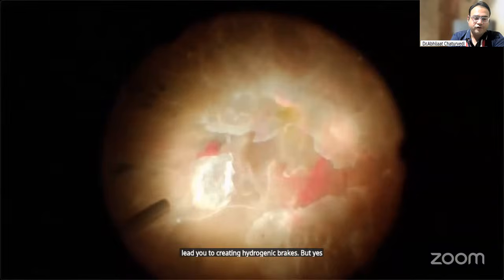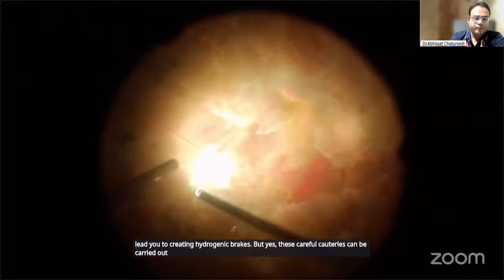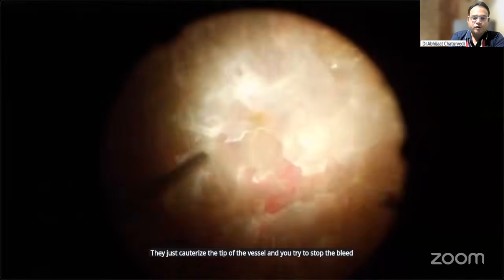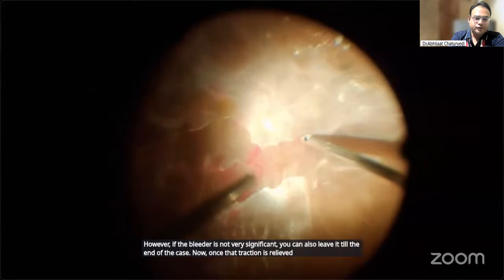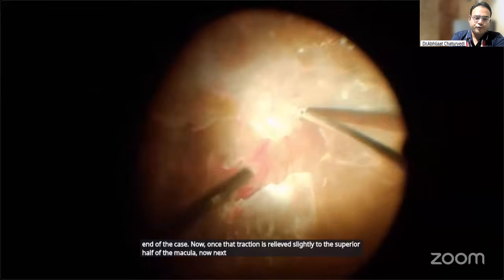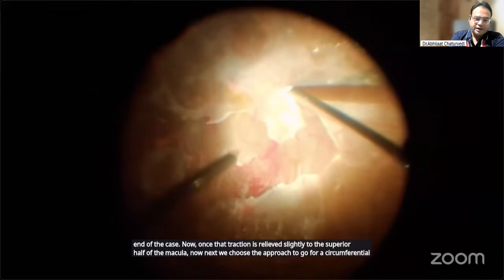But yes, these careful cauteries can be carried out, where you just cauterize the tip of the vessel and you try to stop the bleed. However, if the bleeder is not very significant, you can also leave it till the end of the case. Now, once that traction is relieved slightly to the superior half of the macula, next we choose the approach to go for a circumferential dissection around the disc.